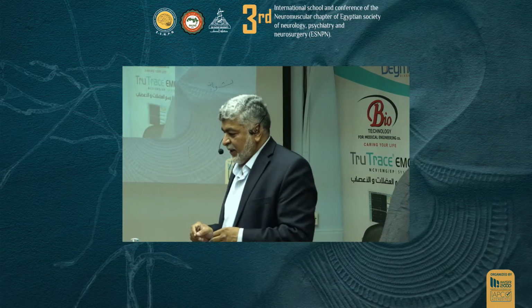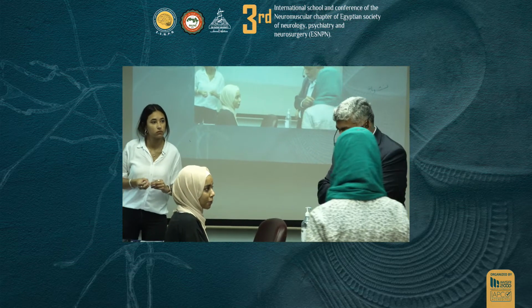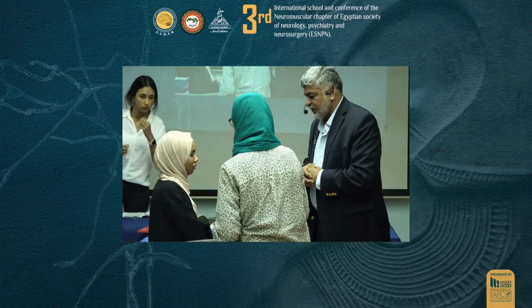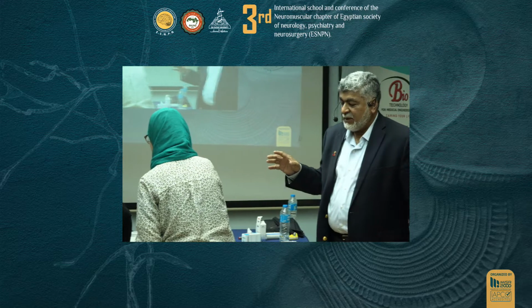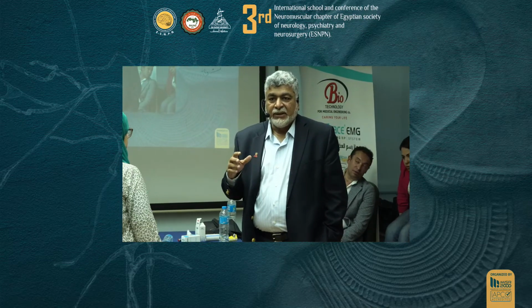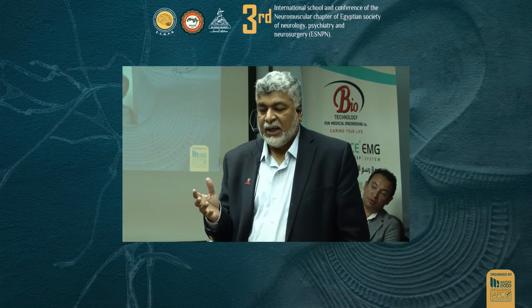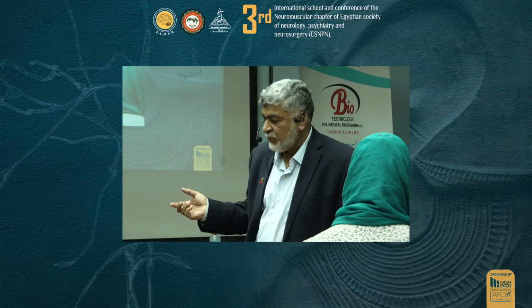Can somebody come? Just explain to her. I'll be using a small needle to examine some muscles. Yes, please, we'll have to take this off, please. Thank you, thank you. So my understanding is, what I heard about this young girl is that the right side of the body is relatively normal. The left side is affected, okay? I would briefly do an exam right now to see if that's correct.